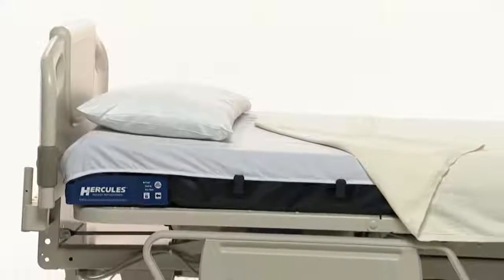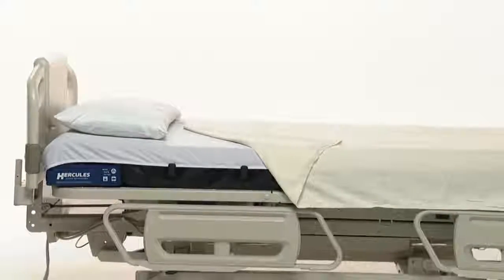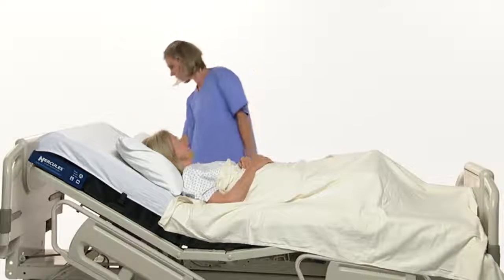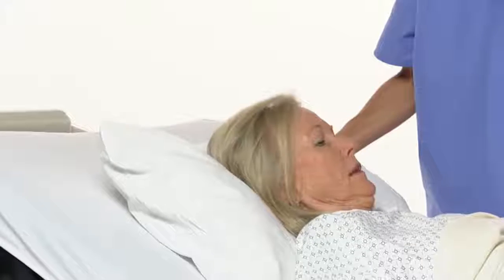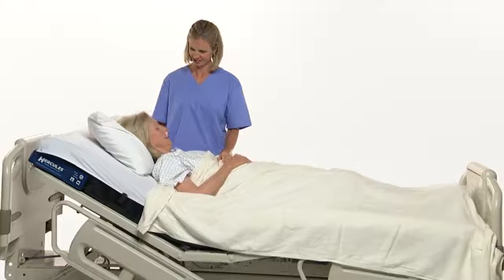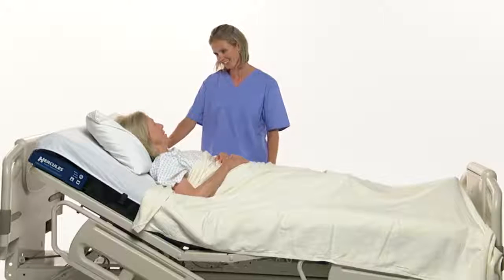Now, the Hercules Patient Repositioner, an innovative new product developed by the Morrell Company, helps solve these problems for both the patient and the caregiver. With the simple push of a button, one caregiver can safely and efficiently reposition a patient up in bed in less than 10 seconds, eliminating the manual lifting events that are a leading cause of back injuries affecting the nursing profession.